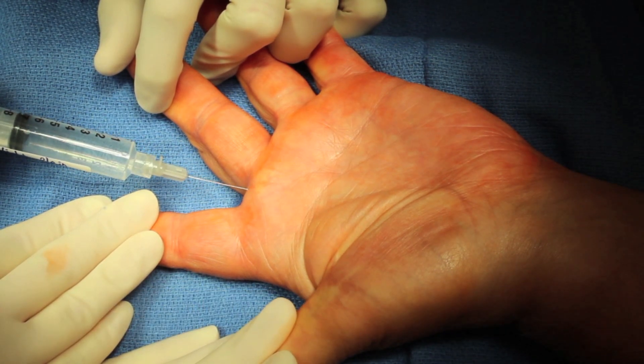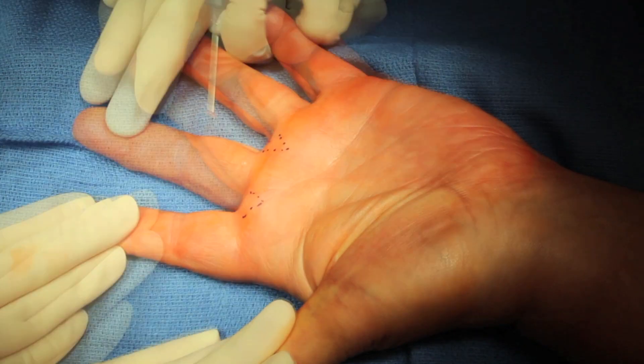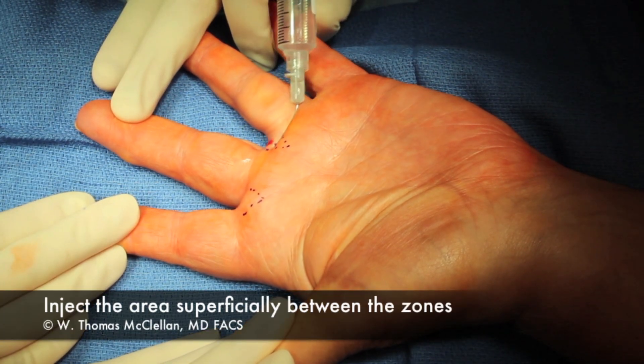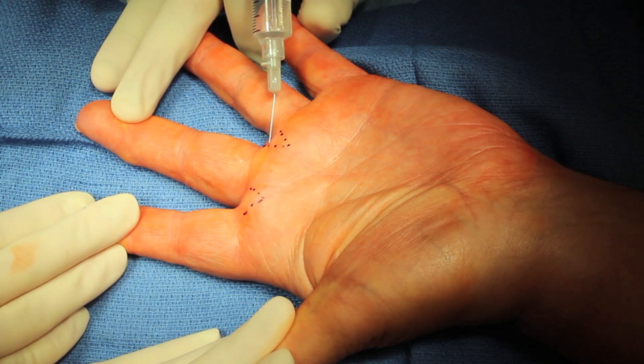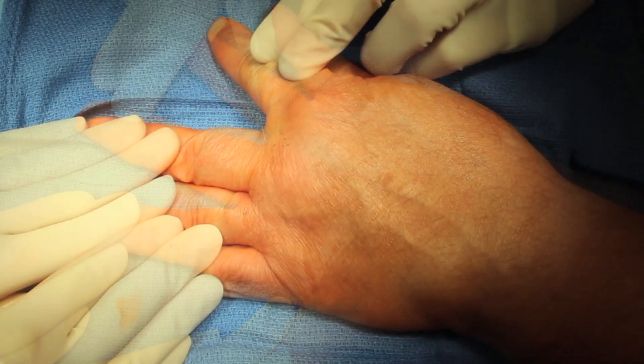Once I have my two aliquots of local anesthetic in those areas, I'll then come across between the injection zones volarly, very superficially — superficial to the tendons — and inject right across the finger.